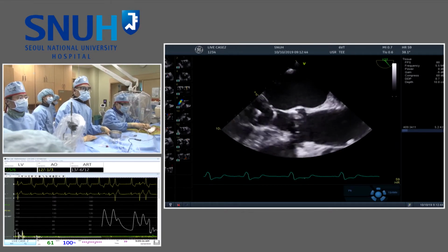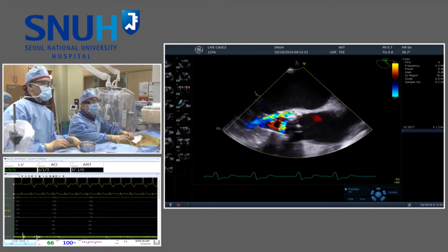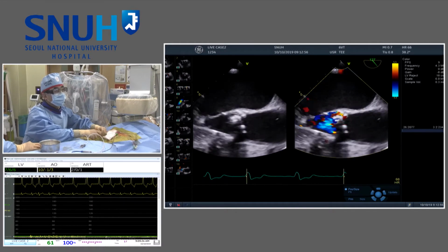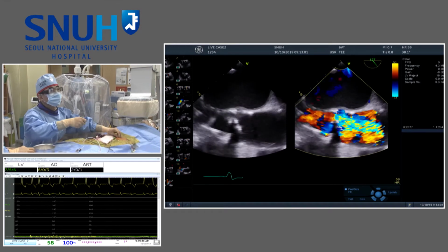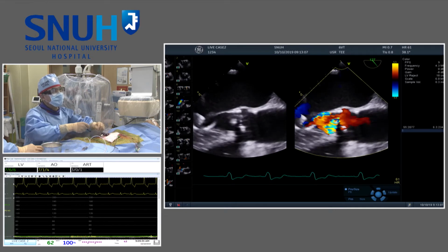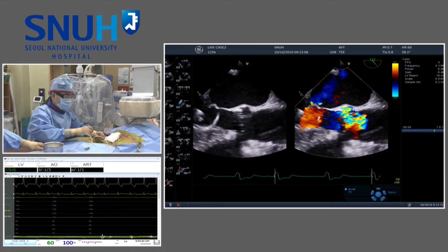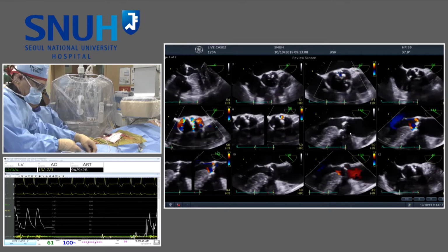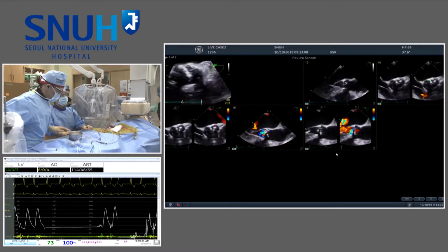They already prepared a 29 millimeter valve without seeing the result of the pre-ballooning. So they did not listen to our discussion. Well, I mean, that's the question with bicuspid valves. With that amount of calcification, you can see that with a 25 balloon, that was already fairly aggressive. If you take a 29, I think my understanding is that you underfill, right? Yeah.